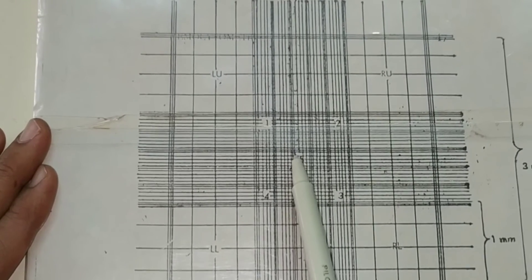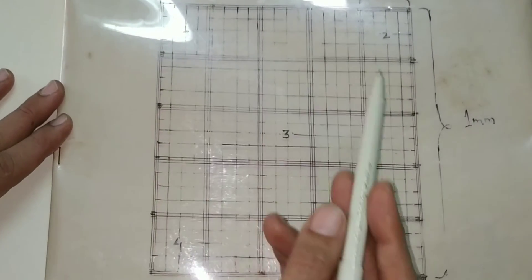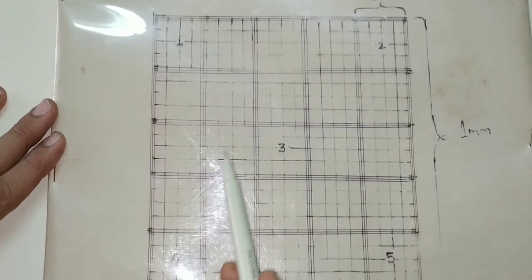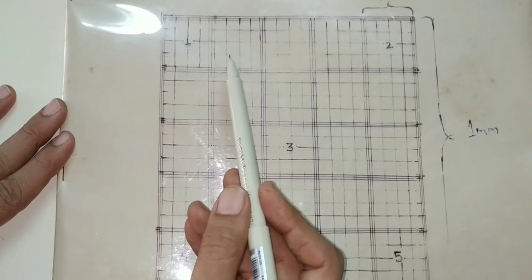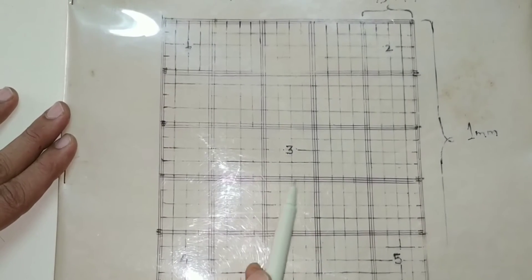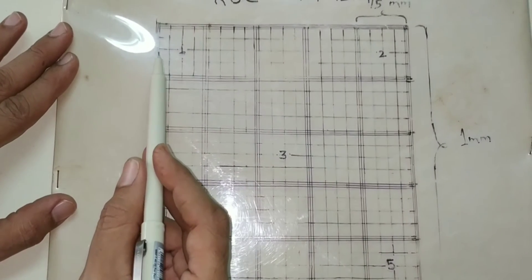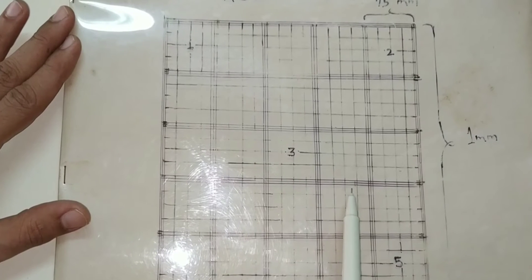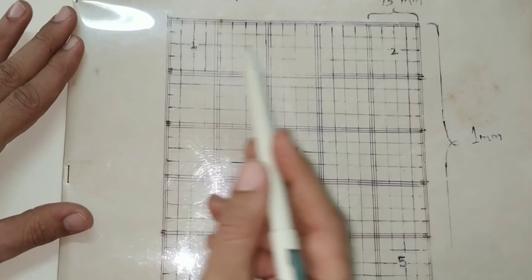RBC count is done under high power. This is the view of the Neubauer chamber in high power. You can see the central RBC counting square, which is further divided into 25 medium-sized squares. Each medium-sized square is further divided into 16 small squares, so 16 small-sized squares are visible in each medium-sized square. Therefore, a total of 400 small squares are present in the RBC counting area.